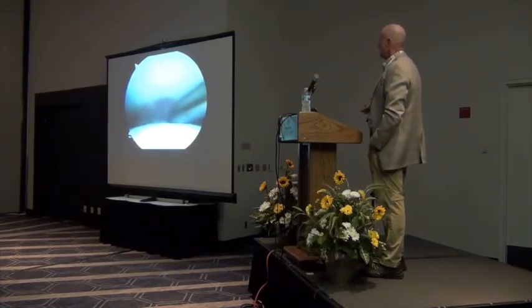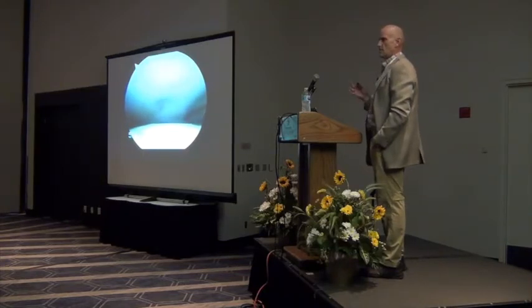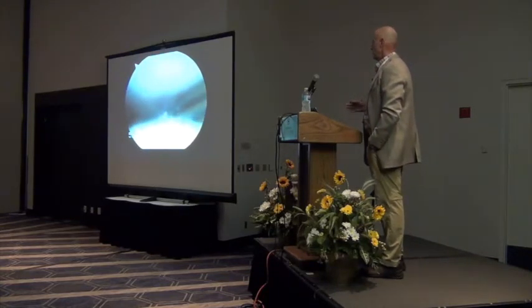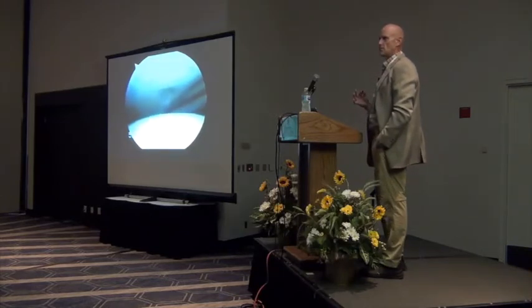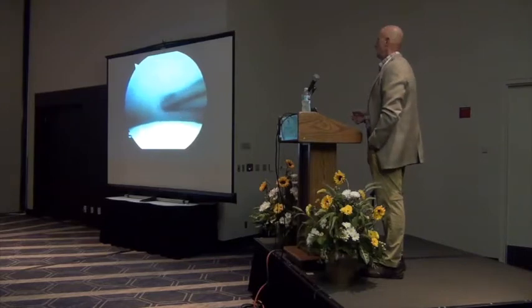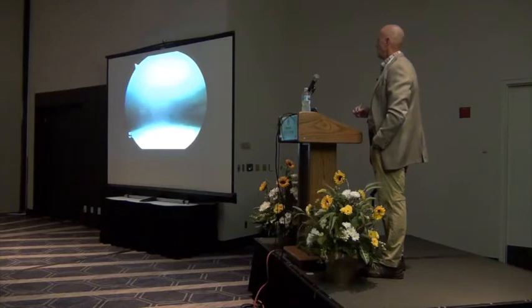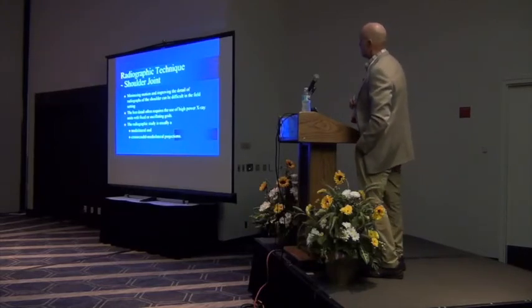And what ends up happening, the majority of the times that we stick a scope in the shoulder, it's for OCD. And I'm becoming more and more disillusioned with shoulder OCDs in that they're usually more extensive than what the radiographs or the ultrasounds would portray. And once you take a lot of the humeral head out, these horses don't do very well. So it would be ideal if that was just a focal cystic lesion, but it ended up being a very large amount of cartilage that was shucked off of there.